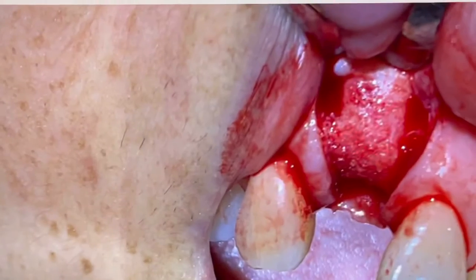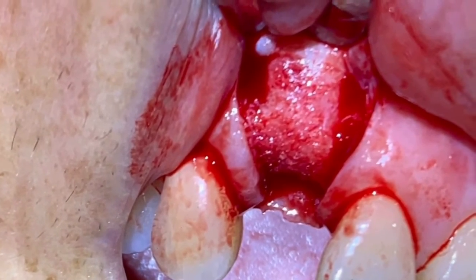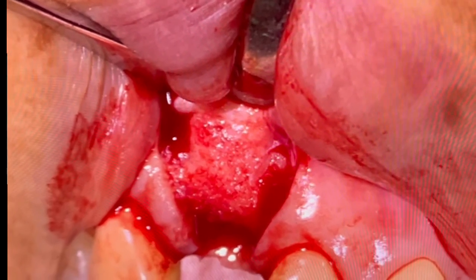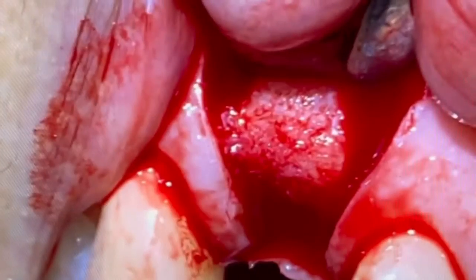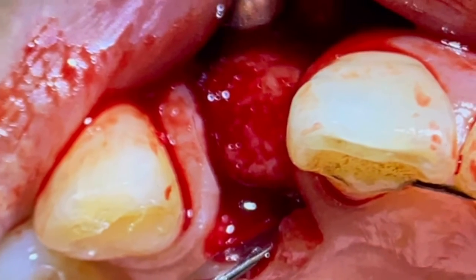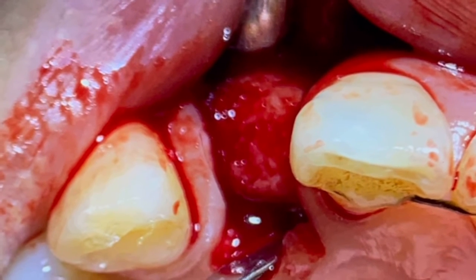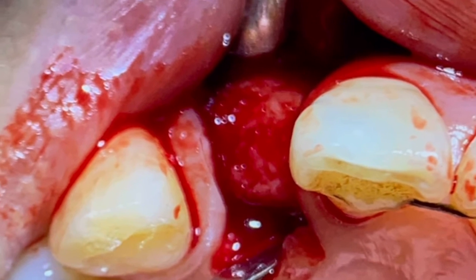So what does that look like when we've gone back in? If you have a look at the time of implant placement, we've accessed the site, and you can see the quality of that bone is significantly improved, and volume is significantly improved. If I get to the occlusal view, you can see the horizontal deficiency is significantly improved when you imagine that there was no labial bone on the outer surface of that tooth.